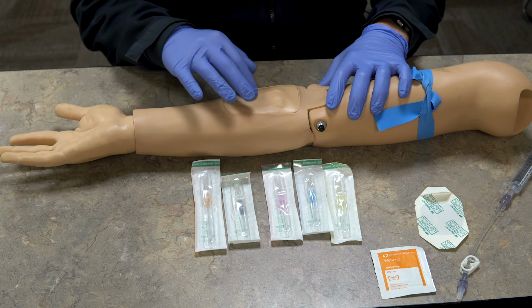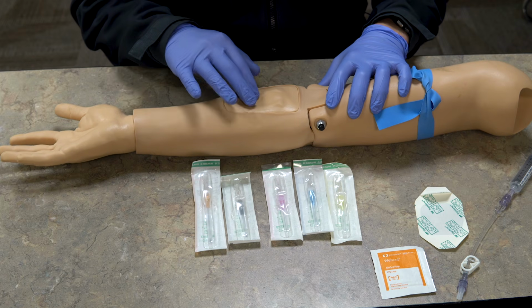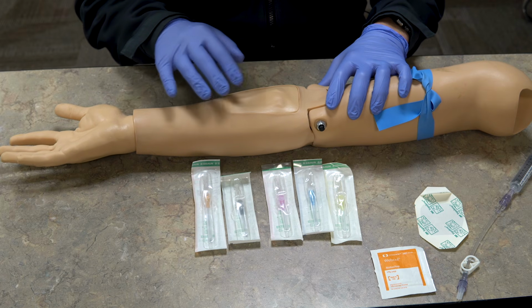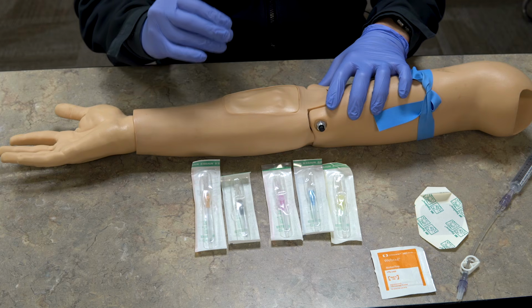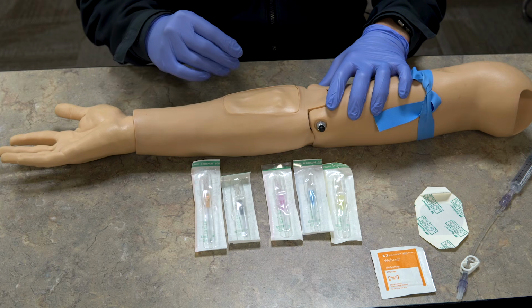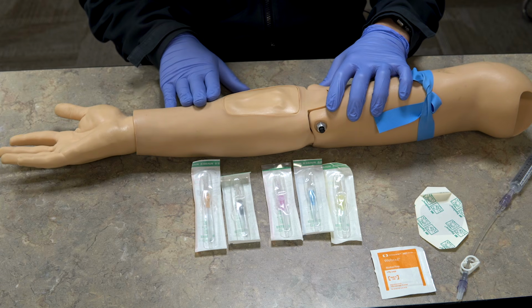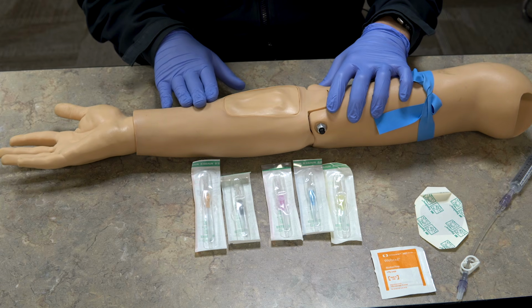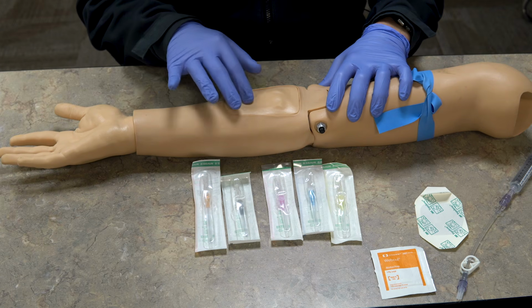The next thing you want to do is you want to palpate them. And one of the best indicators of a good vein is if you can actually feel a bounce to it when you put your finger on it. Because that means that there's like pressure in that vein and that you actually have room for that catheter. So sometimes the veins in the forearm will look really promising, but they're actually pretty flat and won't do well for you when you try to start them. So I always try to feel them and feel the bounce.